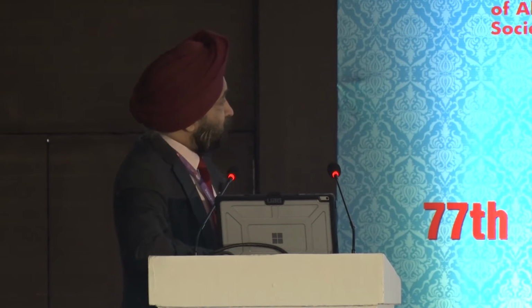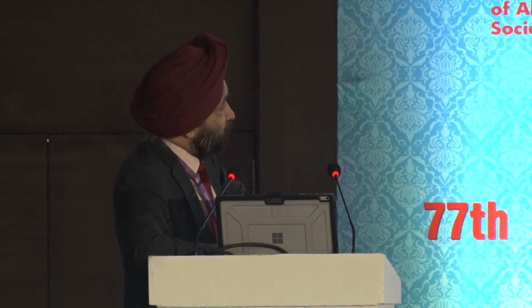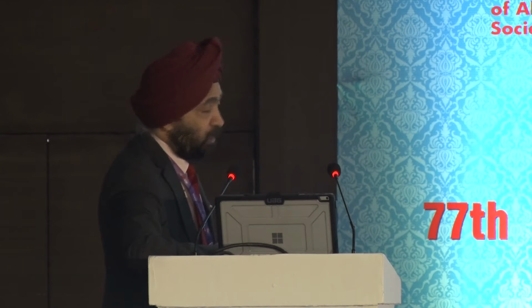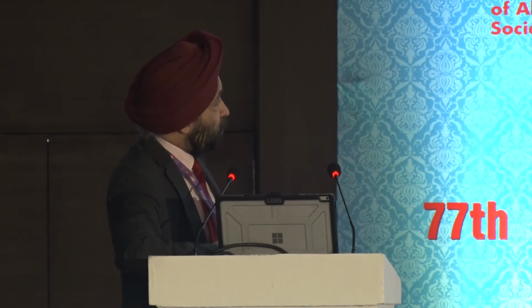Now, if you have a small pupil, what can you do? Actually, this is the lensex. Even in the Catalys system, you can reduce the capsulotomy up to 3 millimeters. So you can reduce the size of the capsulotomy and go ahead with the fractionation of the nucleus.